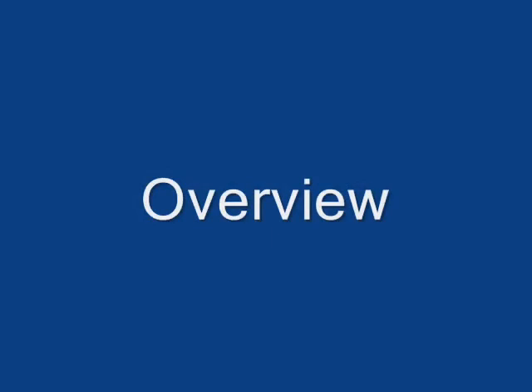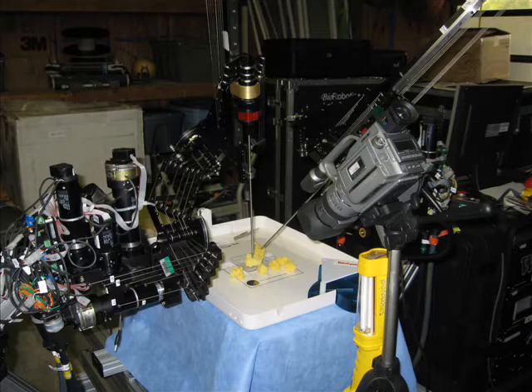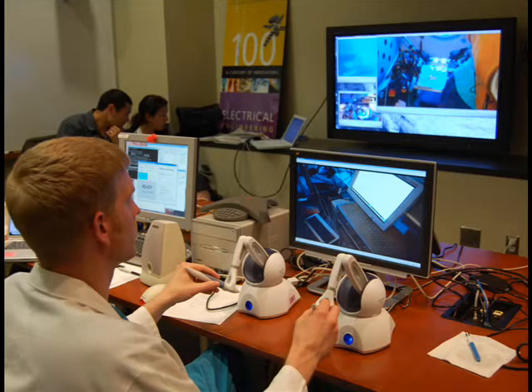The RAVEN consists of three major components: the patient site, the surgeon site, and a network connecting them. The patient site consists of the two surgical manipulators, the patient, and a digital video camera to stream the operative field back to the surgeon. The surgeon site consists of the surgeon site GUI, two Phantom Omni devices, a foot pedal for controlling the surgical manipulators, and a display of the operative field.